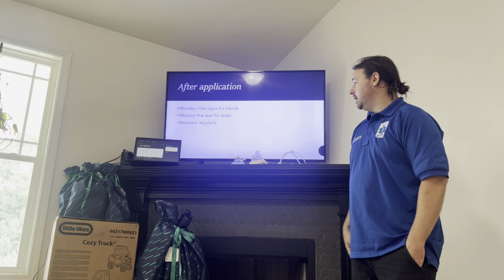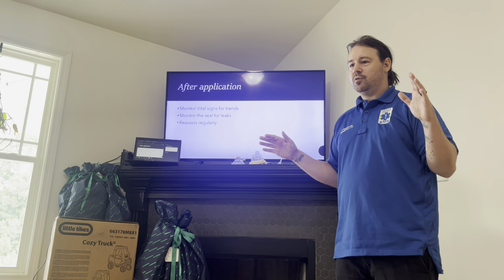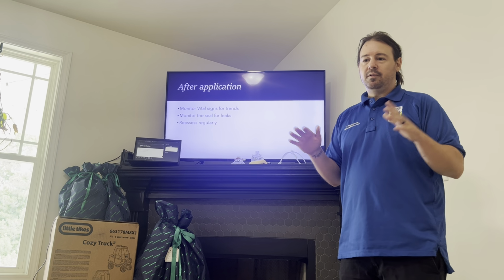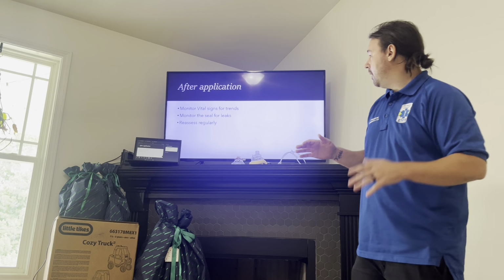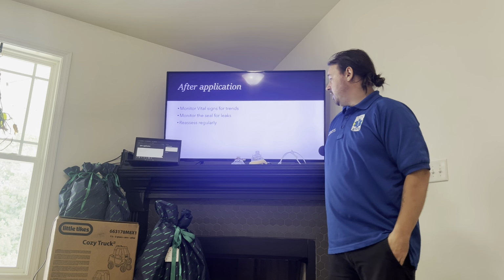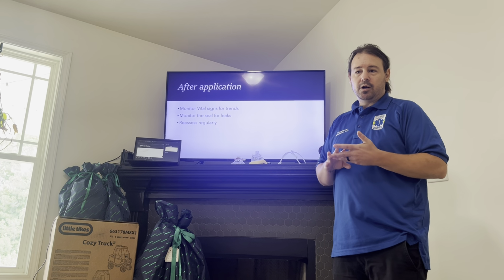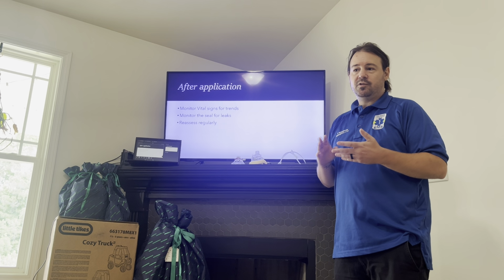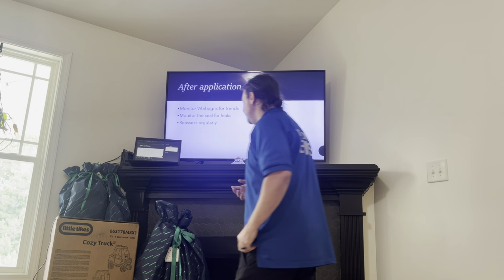Monitor the seal for leaks. I'm beating a dead horse here, but the worst thing you can do is apply CPAP with a leak or multiple leaks, because you will not be getting the effective treatment that way. So continue to reassess regularly, listen to lung sounds, make sure you're no longer hearing rales or bronchoconstriction, or if you are, that you're hearing movement within the lung passages, okay?